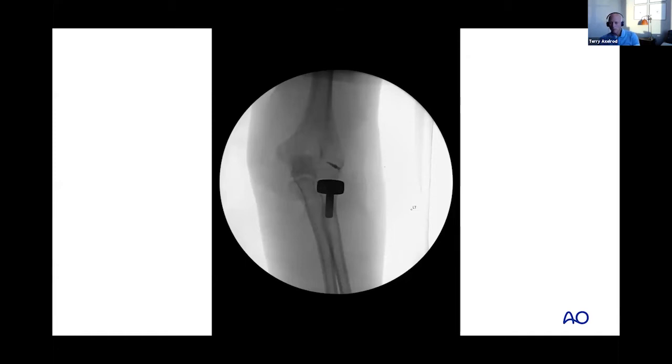Are you a more universal posterior, or do you like the separate medial and lateral exposures? I go lateral only 95% of the time. I find the medial side for acute, simple sort of fractures like this is rare. When you need it, a separate, simple medial approach is probably best. I agree. Raising these big cutaneous flaps, not ideal.